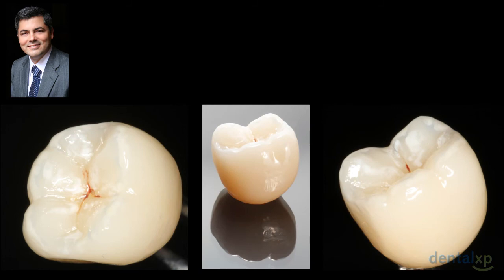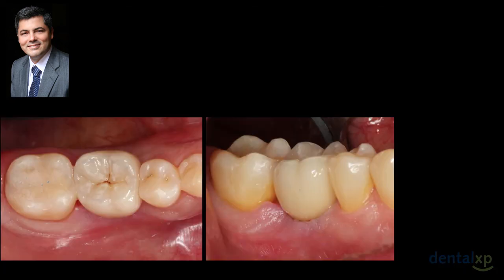And what are you going to get? Whatever you spend the time in developing. It's not the 10 or 15 minutes of the milling machine. It's what you have to do after those 15 minutes to enhance the cosmetic appearance of that crown. And again, this is the crown delivered and cemented right away. Three different techniques on the same patient, the same result with the three different techniques.